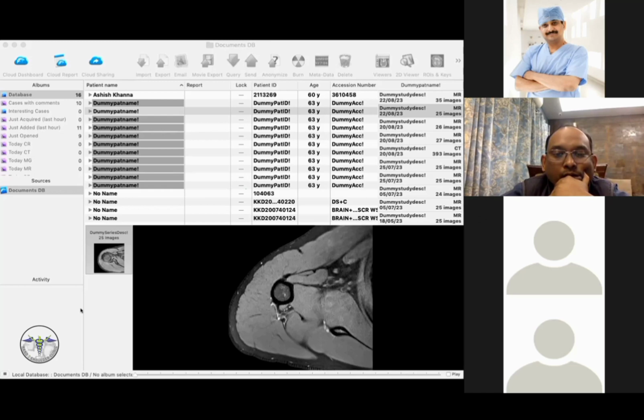X-rays are not so reliable and reproducible. If your angle is different, or the notch view rotation is a little different, everything changes. And our radiographers are not so skilled to give all those special views. What do you say, Amit? I absolutely agree. The literature says a lot about X-ray, but still MRIs should be done before going to the OT.